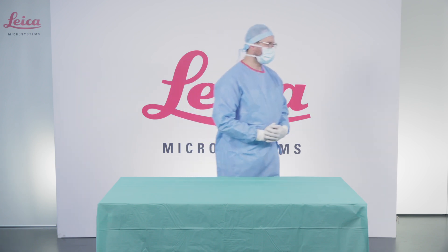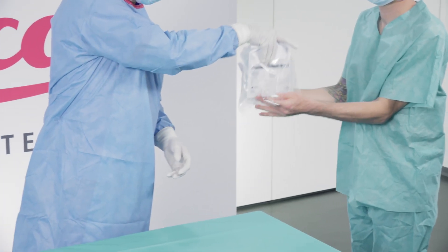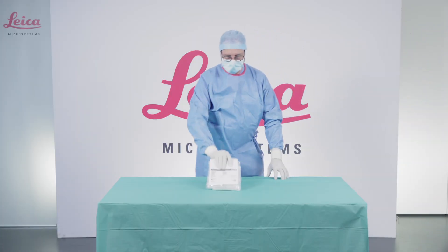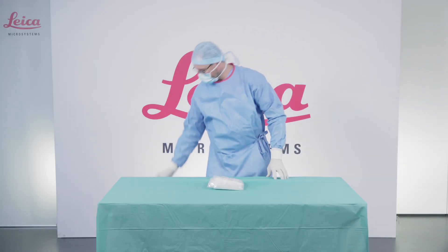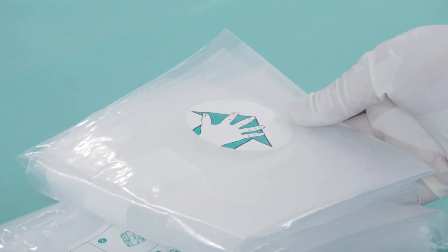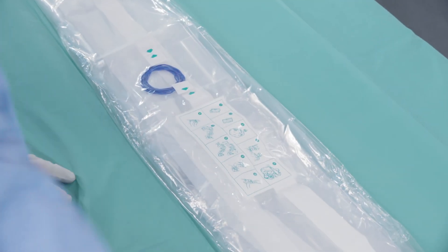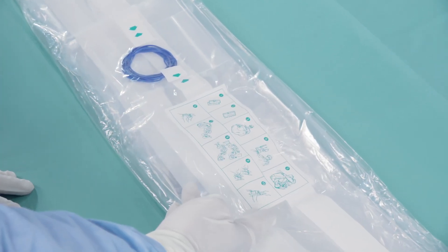The non-sterile nurse should open the drape packaging for the scrub nurse. Grab the drape on the hand picture facing you. Unfold the drape, first to the left and then to the right.